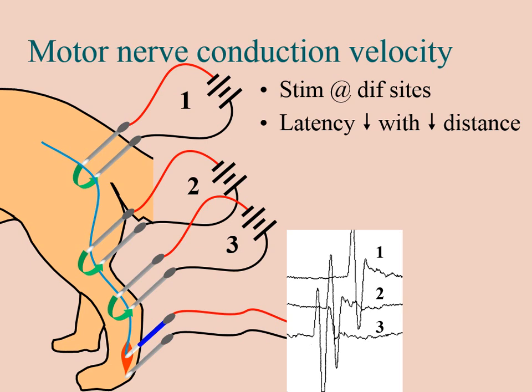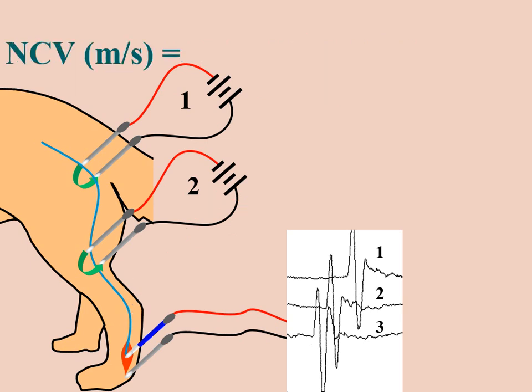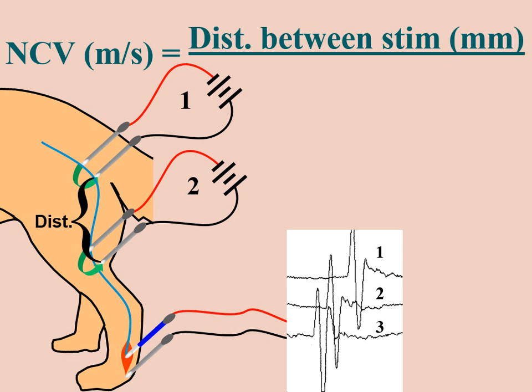And so what we do is we'll actually calculate the velocity. The way we'll calculate the velocity, and meters per second is the units that we're shooting for, we measure the distance between two of the cathodes. Remember, the stimulus is actually going to be at the cathode, so we use those as our measuring point. And we take a ruler and measure that distance between those two stimulation points.